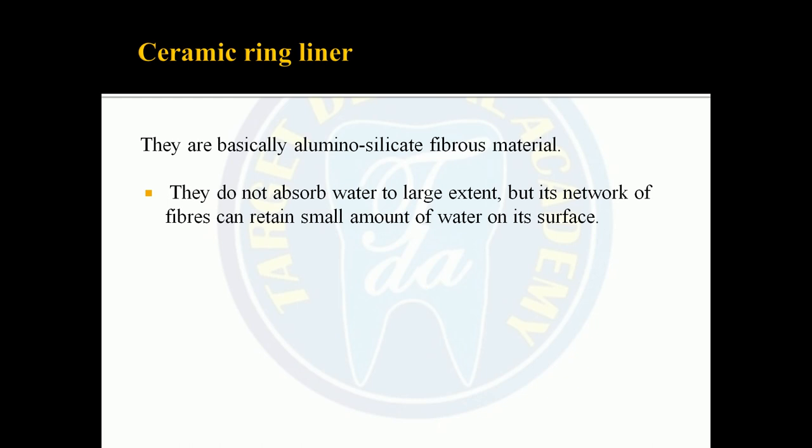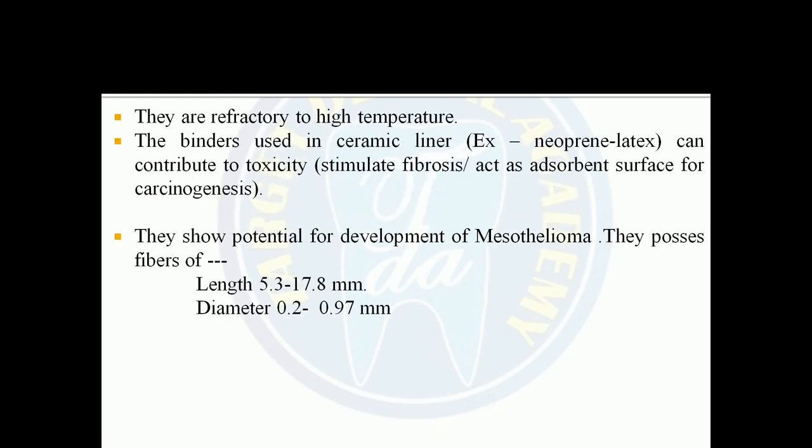Coming on to the ceramic ring liner, they are basically aluminum silicate fibrous material. They do not absorb water to a large extent, but the network of fibers can retain a small amount of water, you can say water droplets, on its surface. They are refractory to high temperature.